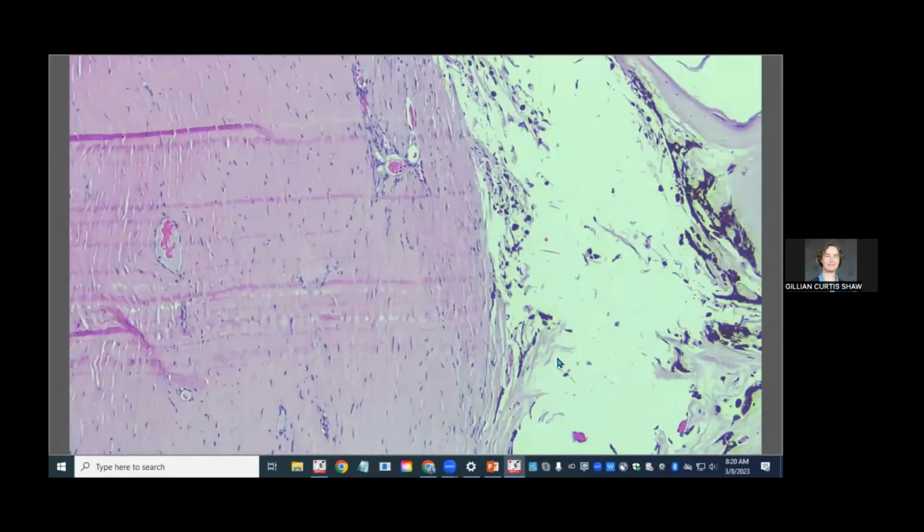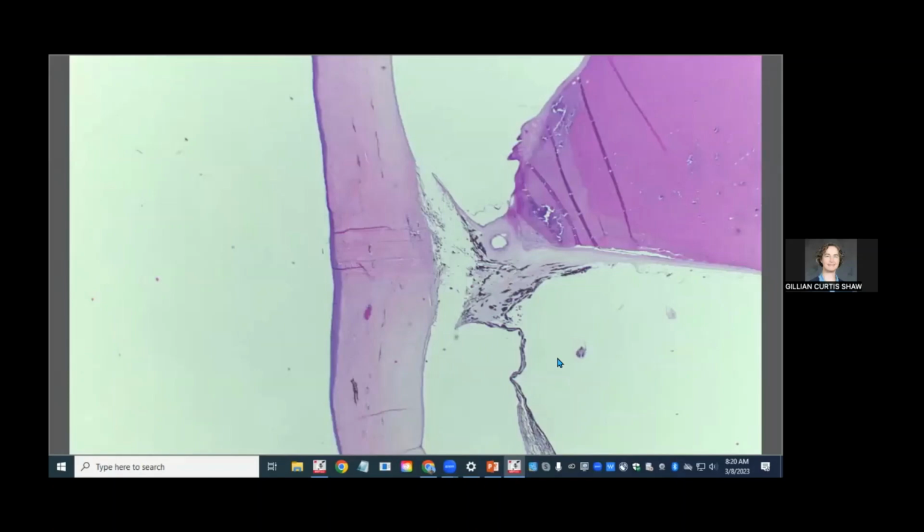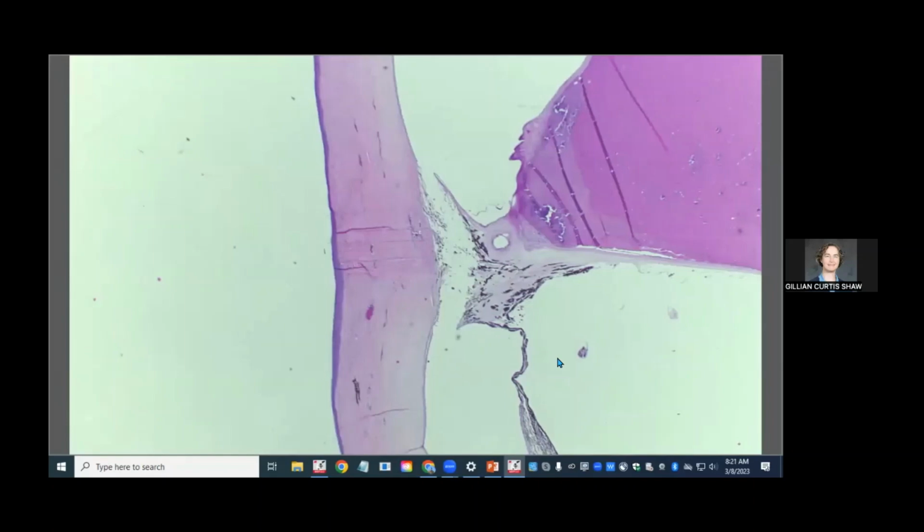This axial defect in the deep corneal stroma and Descemet's membrane with iris involvement, and in this case, lens involvement, is pretty classic for Peters anomaly, which is a rare form of ocular congenital or developmental malformation. Normally the lens sprouts off from the cornea, and in this case, we just had incomplete disconnection from the cornea. And let's look at our iridocorneal angles.